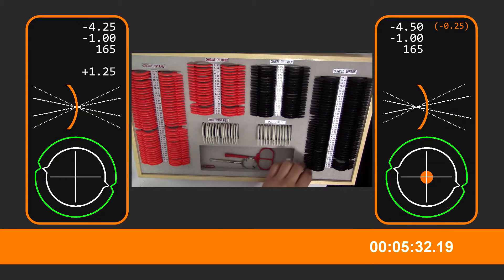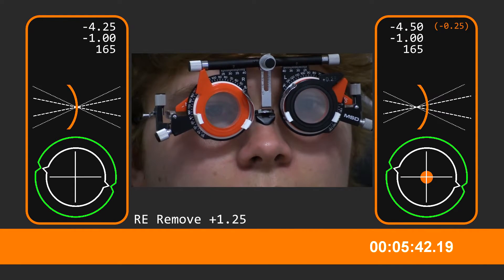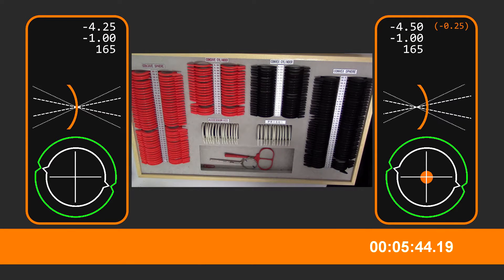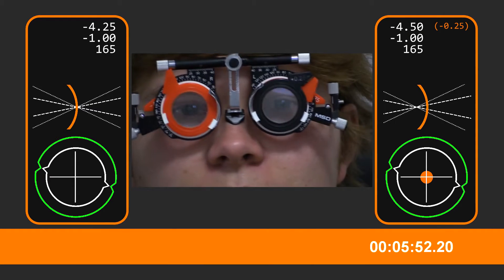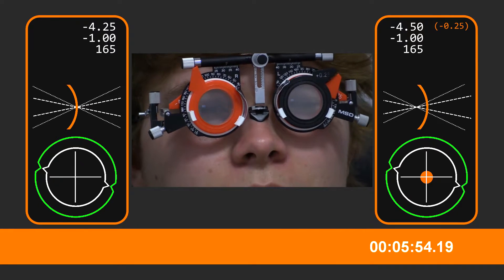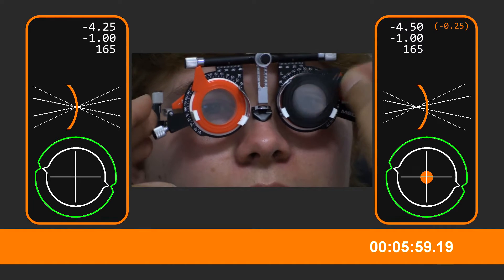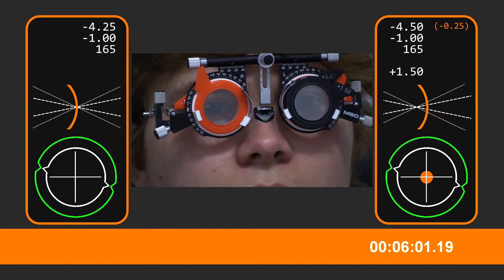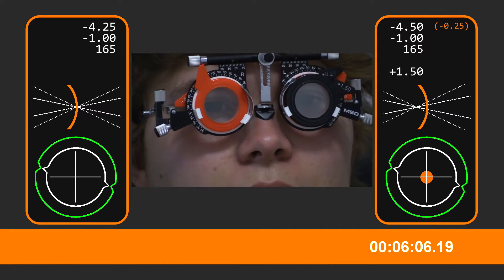See those top lines there — letters there. Keep looking at those letters. I don't know what that's doing in there. It's not going to be a good example. Let me just do those last ones again. There we go. And let's go back to the right eye now. Which one's clearest?